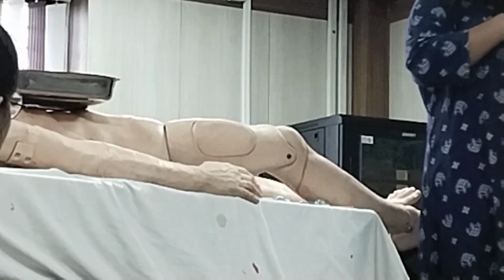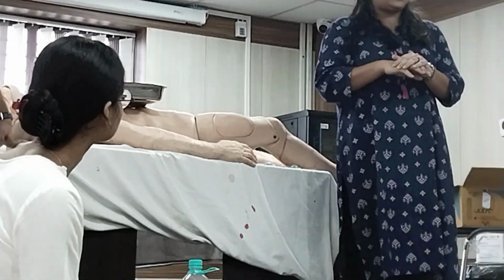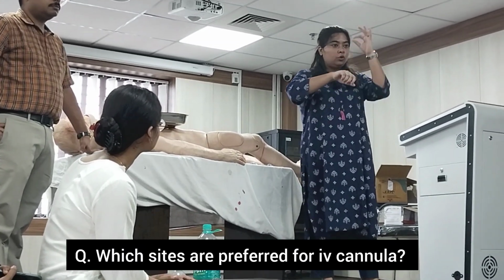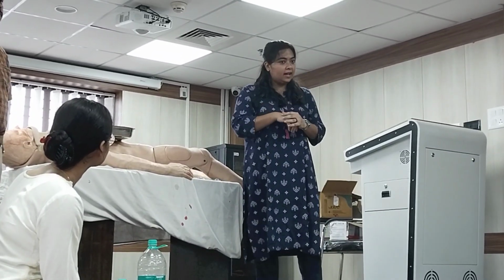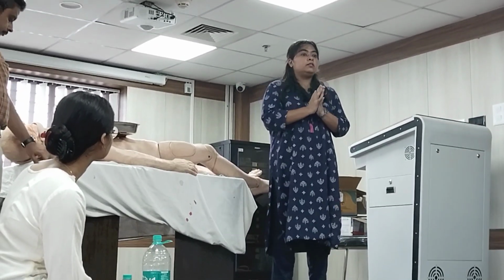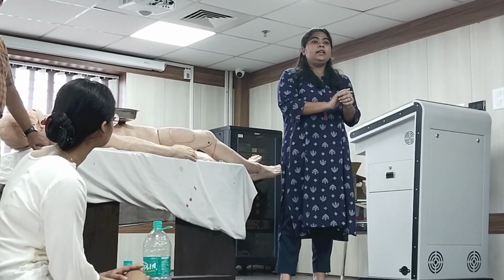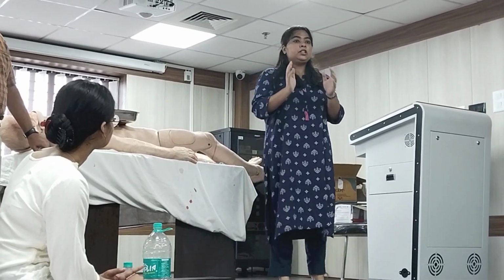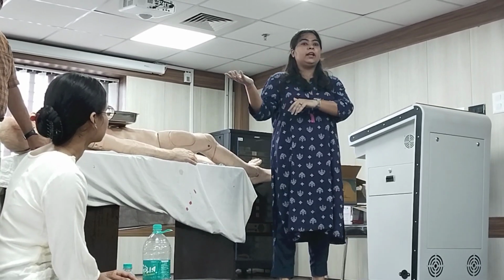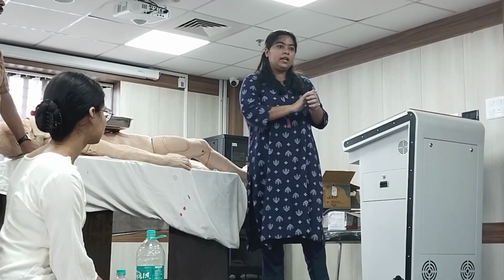Just before inserting, sir has told you: cephalic vein, basilic vein, dorsum of hand. These are the sites we prefer. We don't prefer over the joints. We insert so that you get a long segment and the proper access. In some patients, like chronic kidney disease patients, you don't go for cannulation in the left hand, because the patient may need a fistula or procedures like that. Or a patient with subarachnoid hemorrhage needs DSA. So for that we need to access the left hand, so keep the left hand spared.